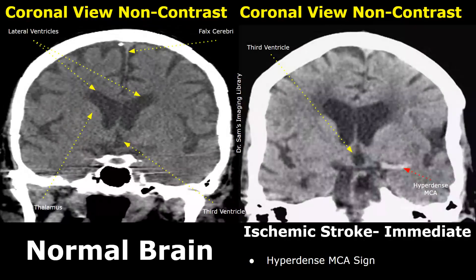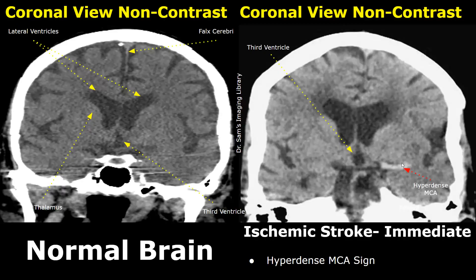These are coronal views showing the brain. The falx cerebri is present between the cerebral hemispheres. These are the lateral ventricles. The thalamus is present at this location. And just below the lateral ventricles is the third ventricle. In this image we have ischemic stroke with hyperdense MCA — we can clearly see a bright MCA over here. It is the earliest sign of an ischemic stroke.